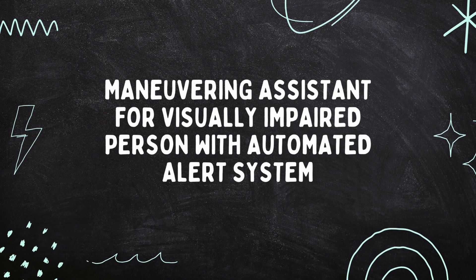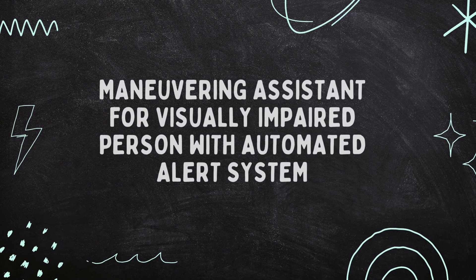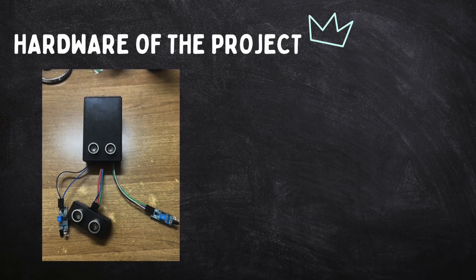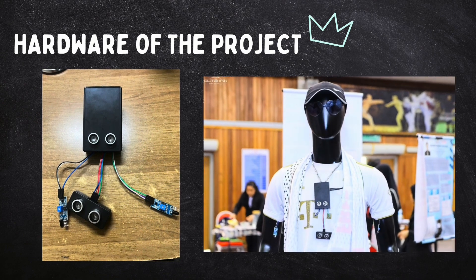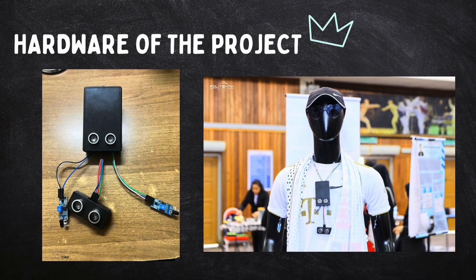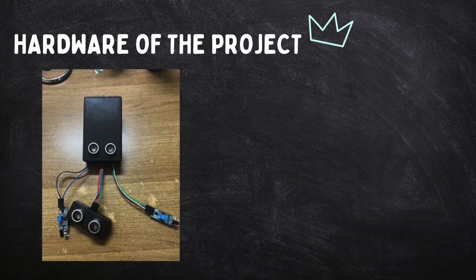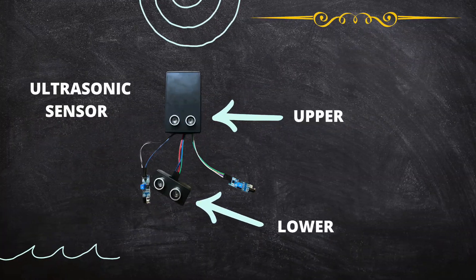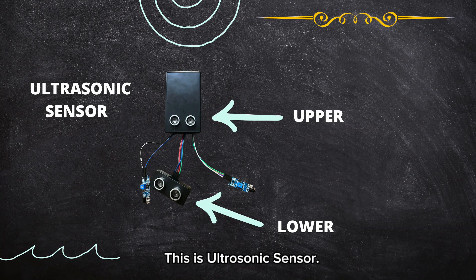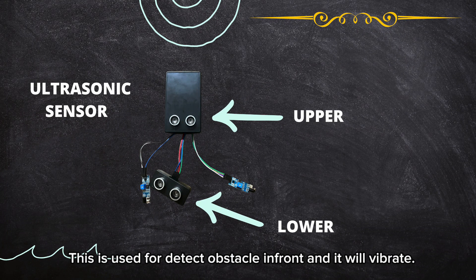This is the Maneuvering Assistant for Visually Impaired Person with Automated Alert System. This is the hardware of the project — it is a wearable device. As you can see, this is the ultrasonic sensor, which is used to detect obstacles in front, and it will vibrate.